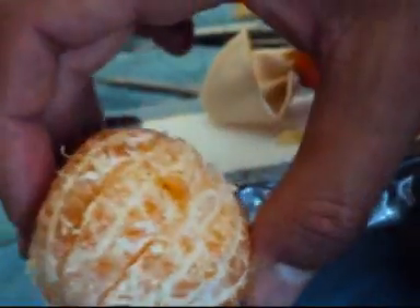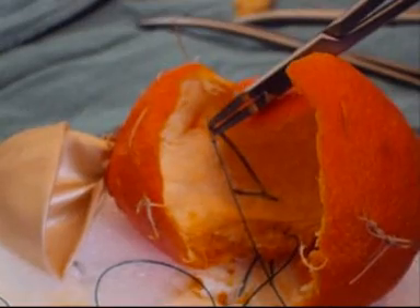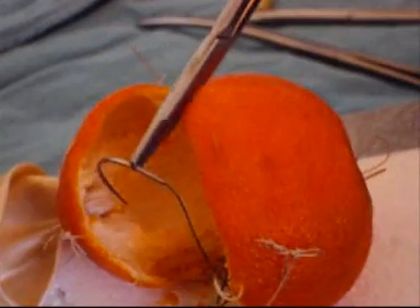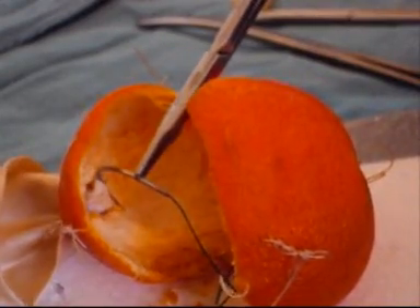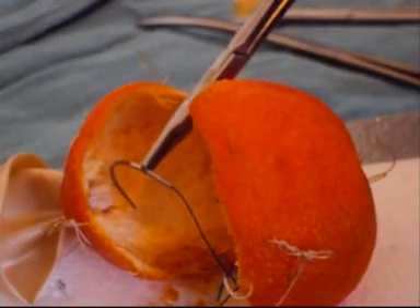If we extend the incision, as we have now removed the prostate adenoma intact, we can — by incising the capsule as just done — see in the bottom the fixing suture which fixed this to the foam board. In this extended model, we can then practice overseeing these as if they were blood vessels at the base of the capsule. More importantly, we can also attend to the bladder neck and in this way oversew bleeders at the bladder neck, again as a principle of the procedure.